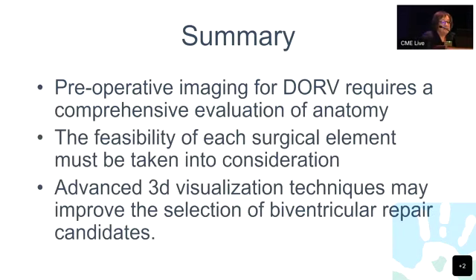So in summary, preoperative imaging for a double outlet right ventricle requires a comprehensive evaluation of the anatomy. The feasibility of each surgical element has to be taken into consideration. Advanced 3D visualization techniques may improve the selection of biventricular repair candidates.